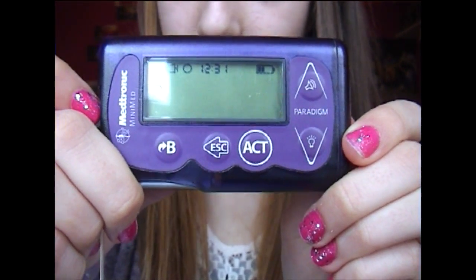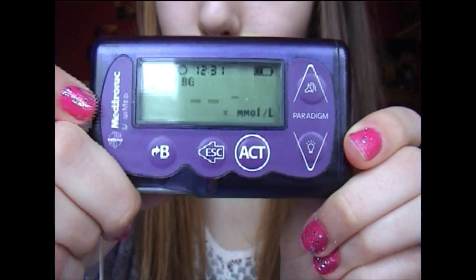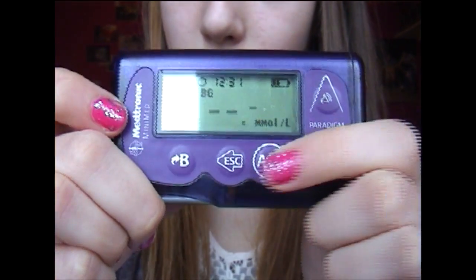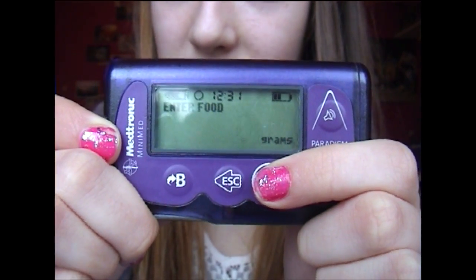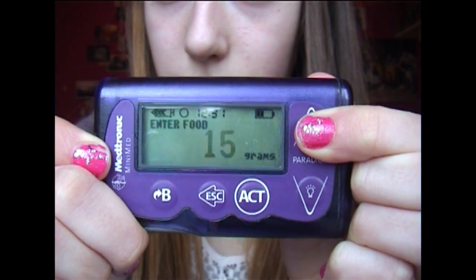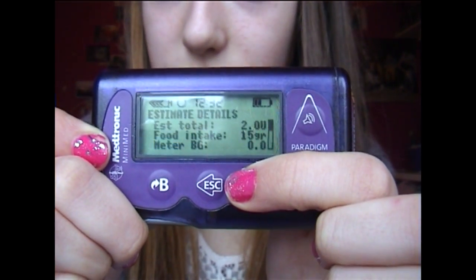So there's a B for bolus button which you can press to give yourself insulin for your carbs. Your blood glucose reading will already be there because the pump comes with a monitor which Bluetooths your reading to it. I will then press act, then program in the amount of carbs I'm going to eat — say I had a piece of toast, that would be 15 carbs. I then press act and it works out the total for me.